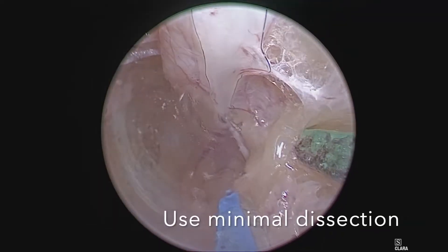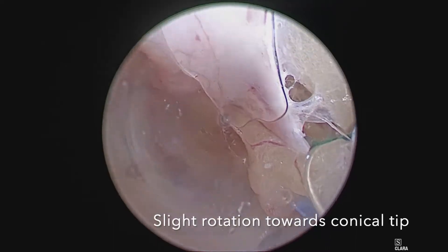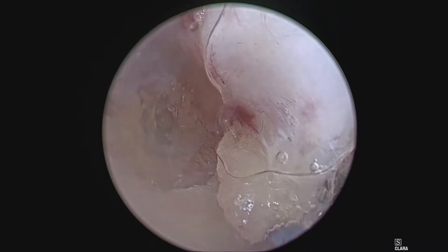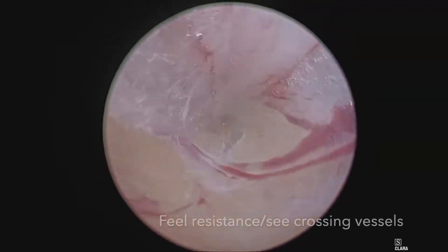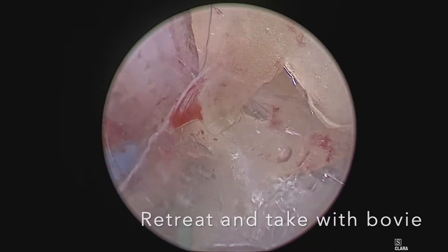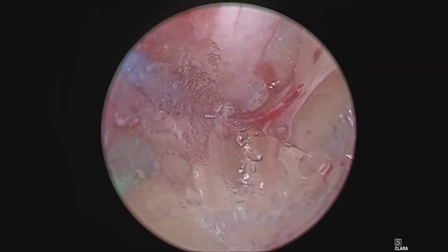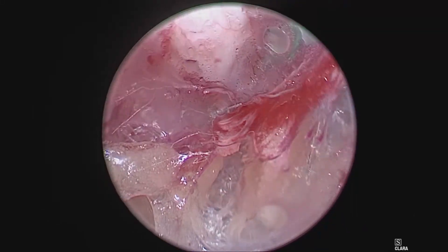You don't need to do more dissection than this. In fact, consider taking the branch without any dissection. Slight rotation towards the conical tip — bovey, seal the branch. While staying in exactly the same position, slide your blades out and the branch will cut and seal. If you feel resistance and see crossing vessels, rotate your scope to 3 o'clock or 9 o'clock and take both sides of these crossing vessels. Here I'm cauterizing any bleeding that I see in the posterior tunnel, and I like to seal and cauterize both sides of the crossing vessels.